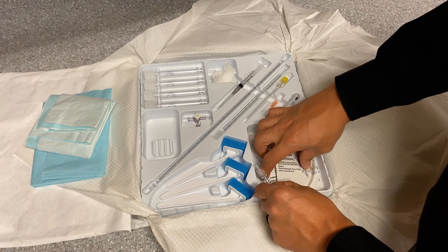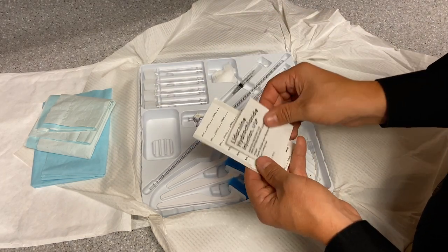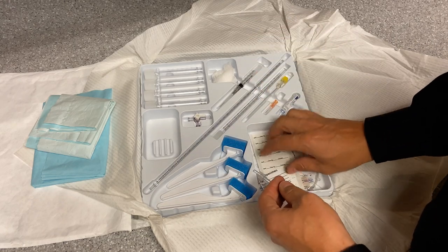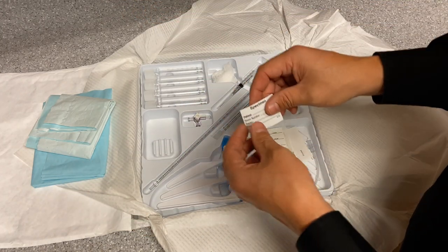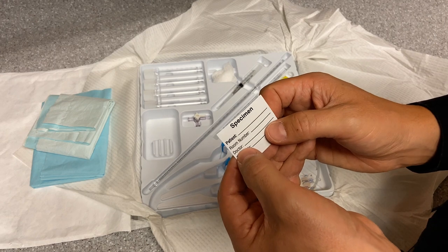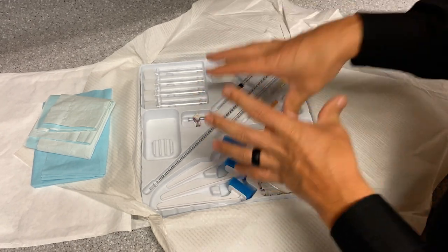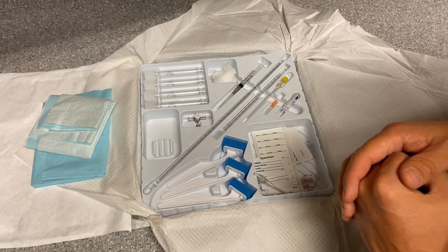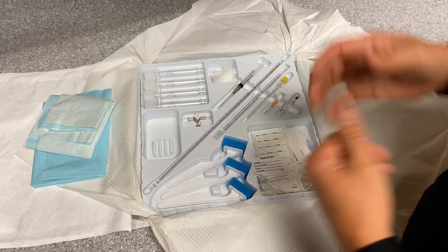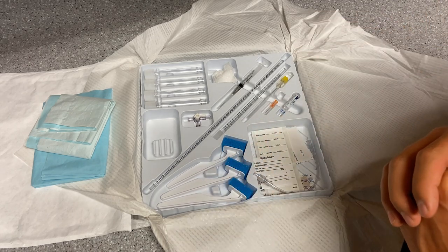Other things contained in the lumbar puncture tray include a band-aid to place over the area once you're done, drug information about lidocaine, and stickers to label your specimens. Before sending the vials to the lab, make sure they are labeled with the patient's identifying information — including room number or medical record number, your name as the provider performing the procedure, and the date and time of collection. If the lab receives unlabeled specimens, they cannot process them and your patient will unfortunately have to undergo the lumbar puncture again. So make sure everything is labeled correctly while it's in your presence. That covers the contents of a standard lumbar puncture tray.